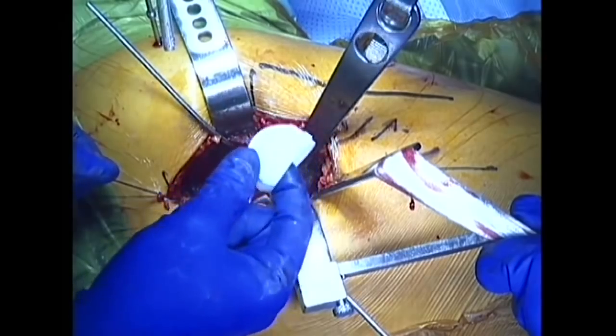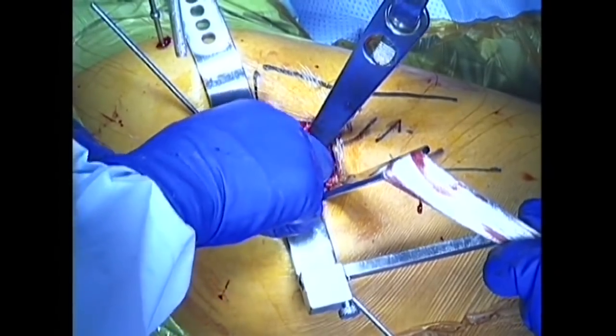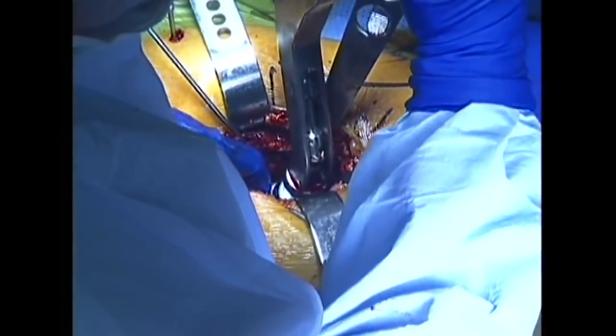The smooth plastic polyethylene liner is clicked into the metal cup. This plastic liner will later articulate with the new head of the femur.